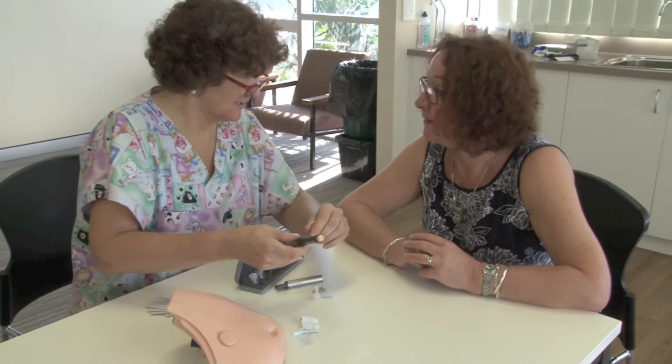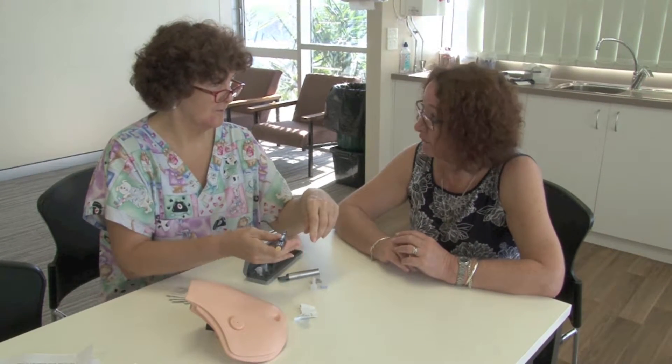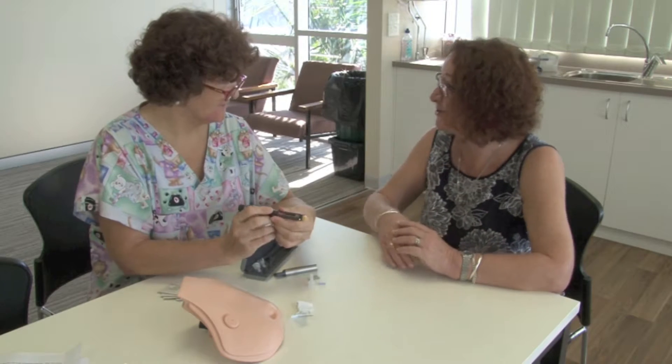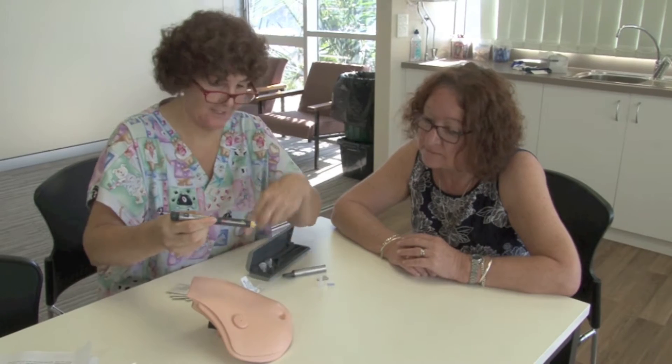I think that's why they sent me around to show you again. Because you're due to go and see the diabetic educator? Yes, I'm going to see her on Friday. I'll be able to show her how I can do it. That'd be good. So I've just brought along this little demonstration tummy here.